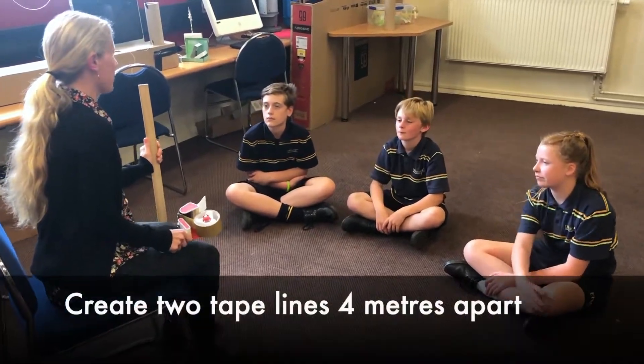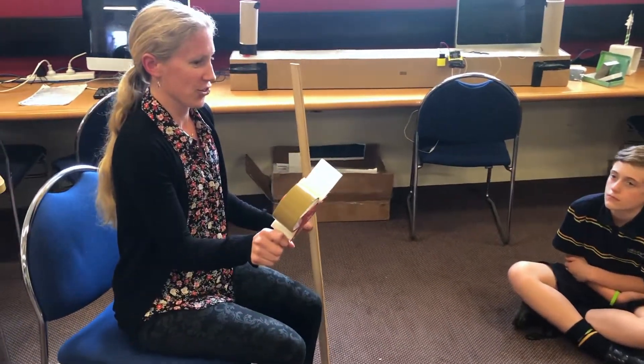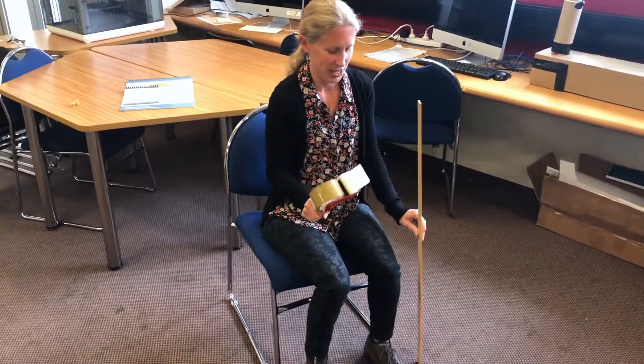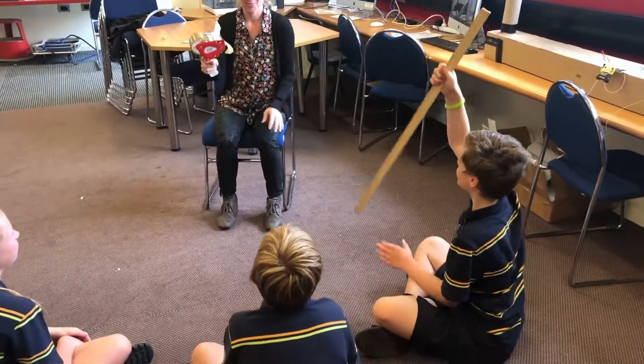Now what we've got to do is measure our four metres on the ground. We've got a metre roller to measure it out, and we've got some tape to make lines that we're going to stand on. So who wants to measure?